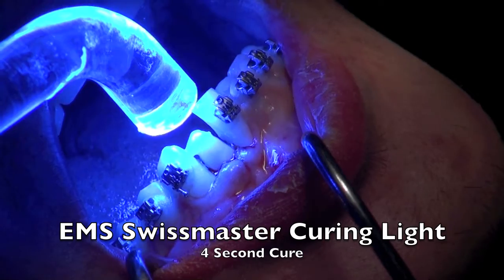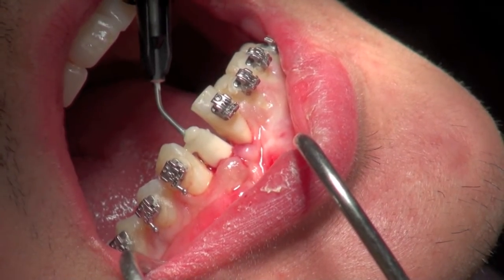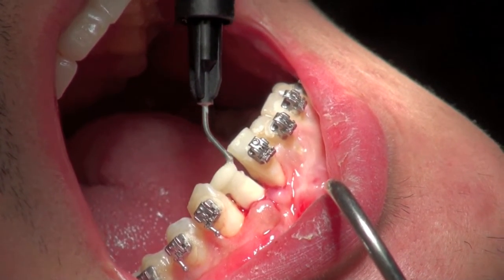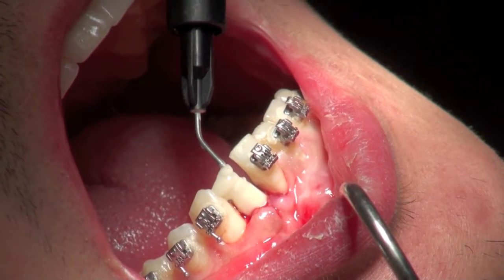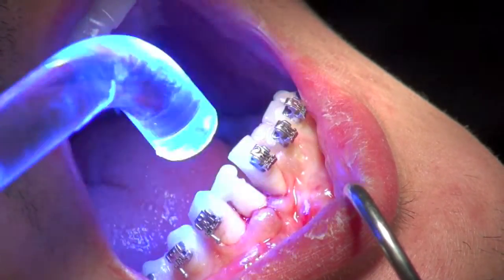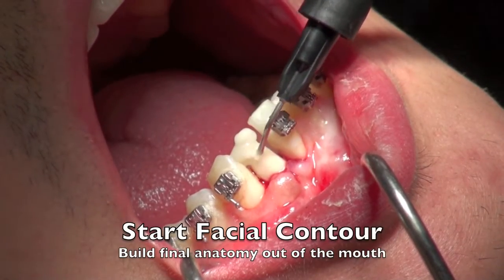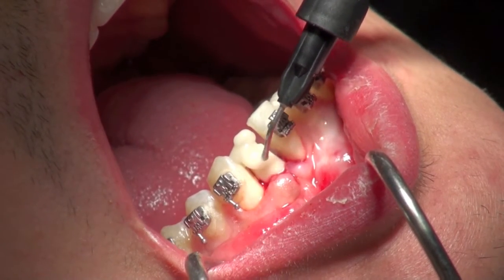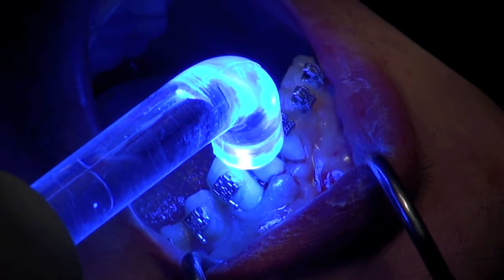I like to pick up the contact and the buccal surface so that I can create most of this out of the mouth. I'm not making a model or creating any other records, so I'm saving time. At the same time, we're able to get this temporary in to help support the tissue. We're actually going to gain some tissue because the space where the implant went in has tissue pushed forward, since the incision was slightly lingual. You can see we get quite a bulk of tissue in this particular situation.